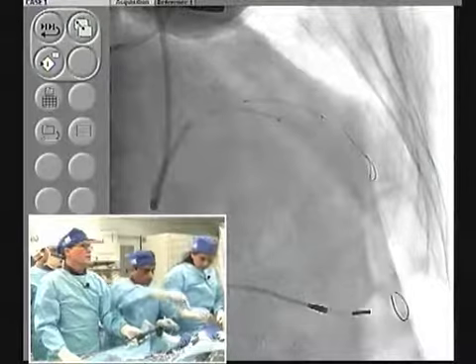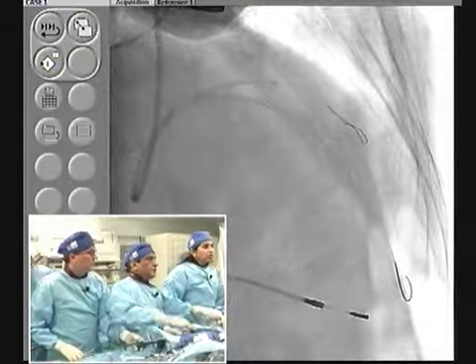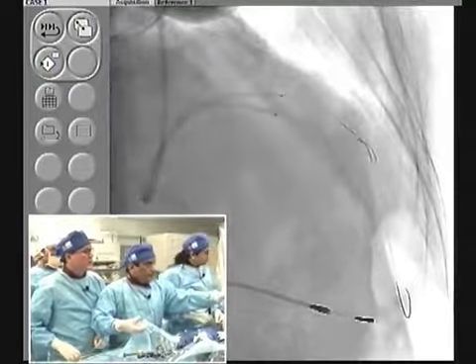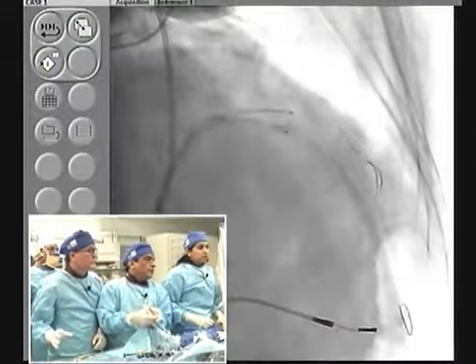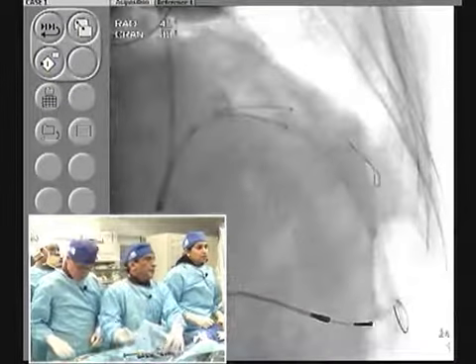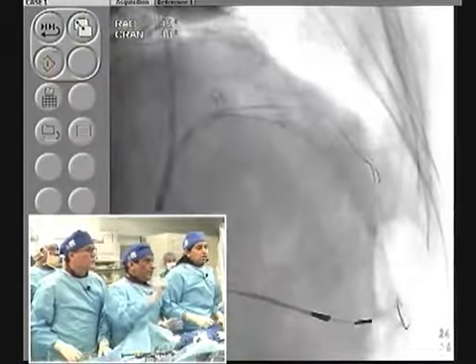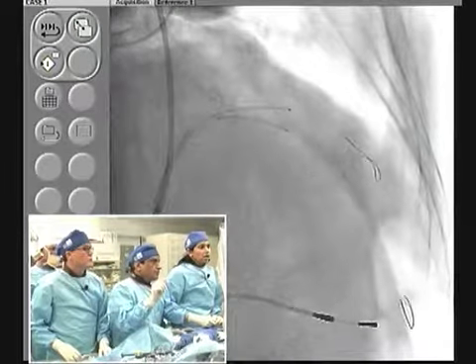Okay, good. Bring the other one. But first we are here. Ready? No, 1 second. We document here first. Both proximal dots overlap. Good. Now, it's covering. We just want to make sure the diagonal may go 1 millimeter in here first. Go. Diagonal 1 millimeter, that one. So it becomes overlap.